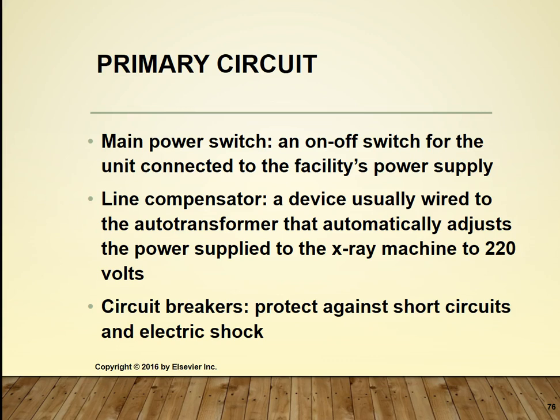So if any of you have been in the medical field for any reason, anytime you go to a facility, they have what we call red plugs, and those red plugs are probably in other businesses too, but in the healthcare facility, they're even more important, because what are we dealing with every day? We have patients who don't need their machinery to go down. So whenever you do a red plug for your machines, that means that it's connected to the generator. If you're working in the middle of a storm and the electricity goes out, those red plugs, number one, they have a circuit breaker in there so it won't fry your machine, but it also means that once the generator kicks in, you can still use that piece of equipment.